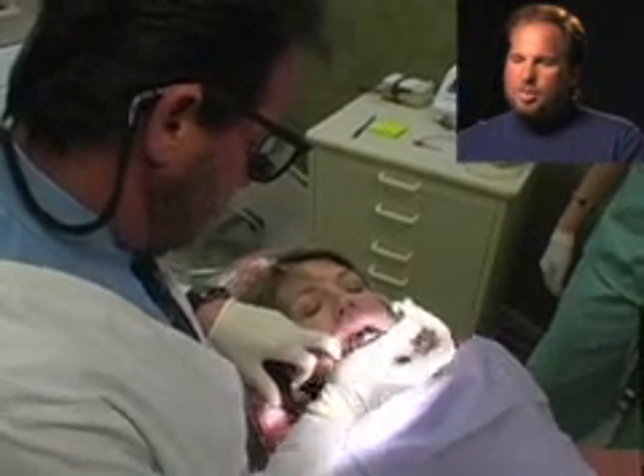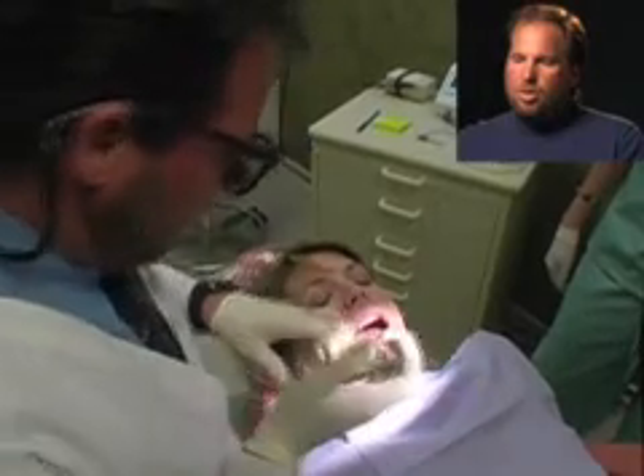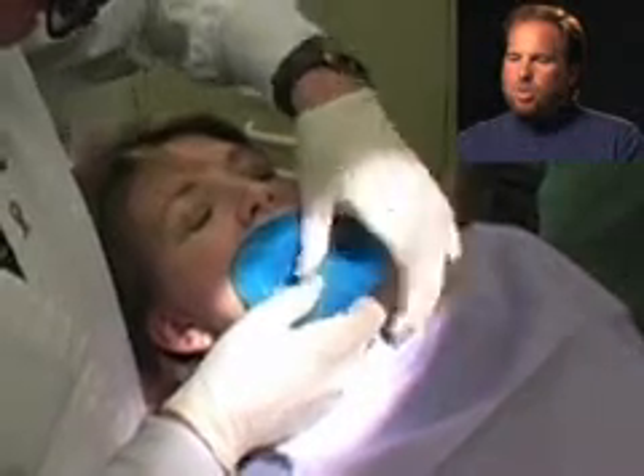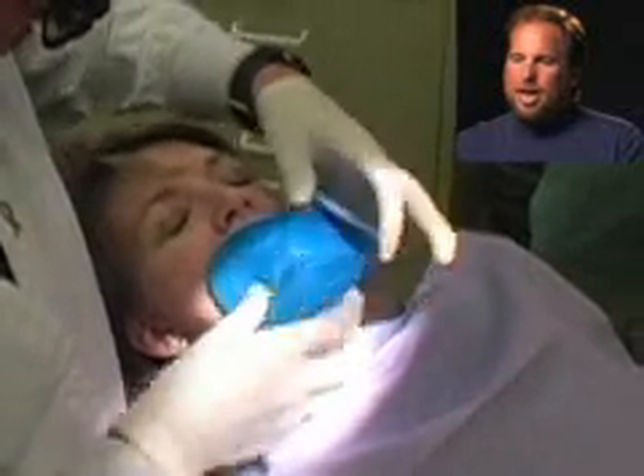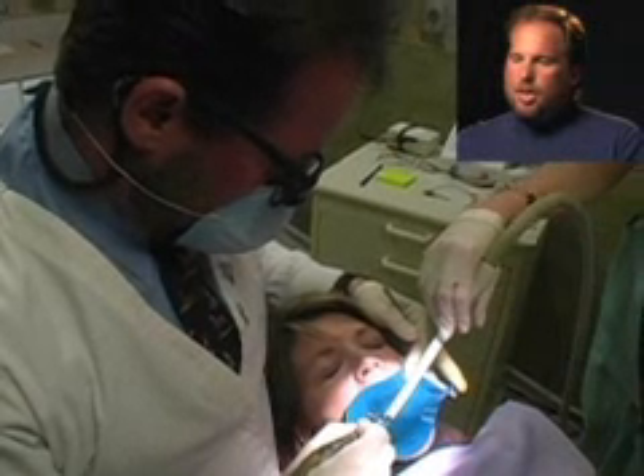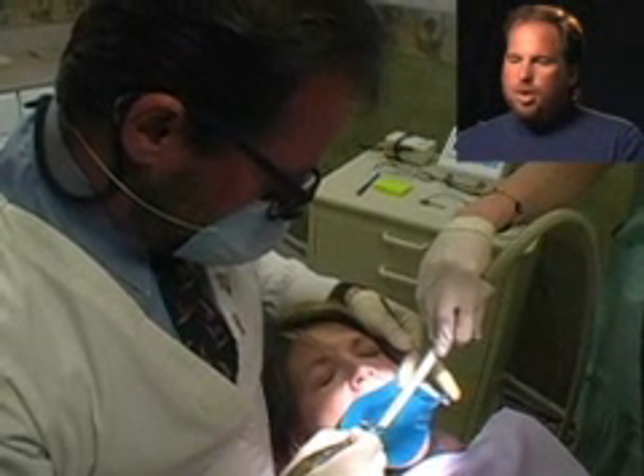We go ahead and place a clamp around the tooth that we're going to root canal. Then we're going to isolate the tooth with a rubber barrier called a rubber dam. This isolates the tooth and keeps the area clean while we're working. It keeps debris out of the mouth as well.